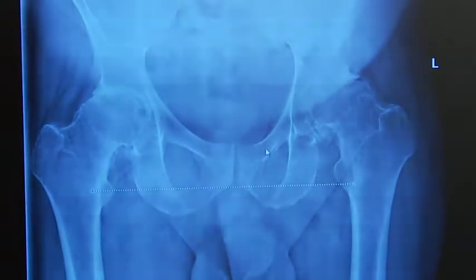I also see that he's got quite a bit of roll to this pelvis when he's standing straight up, and it looks like he's got no offset on this femur, but a fair bit of offset over here, or at least a neck shaft angle. It's more varus here and more straight up and down here. With that appearance to the femur and the roll of the pelvis, and after examining this gentleman and seeing that his lesser trochanter profile is quite bigger over here, you know that this hip has a pretty significant external rotation contracture, which throws off your templating in terms of your offset. And we'll see how that played in this case.